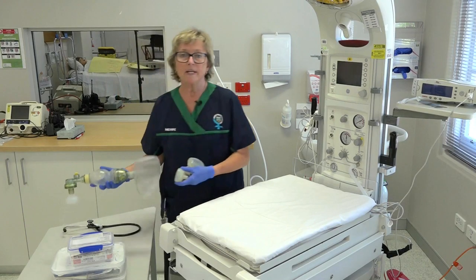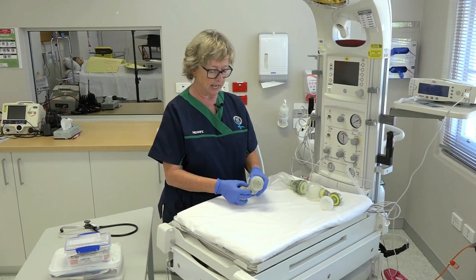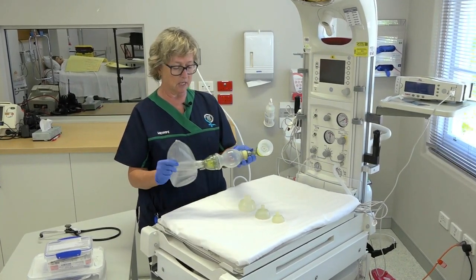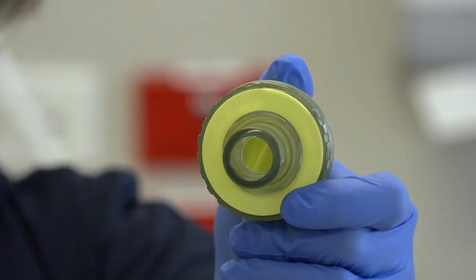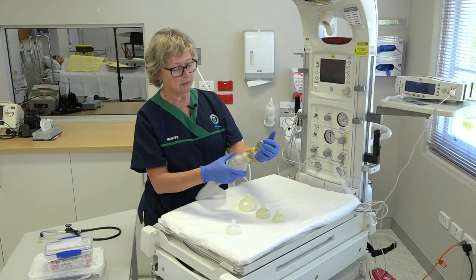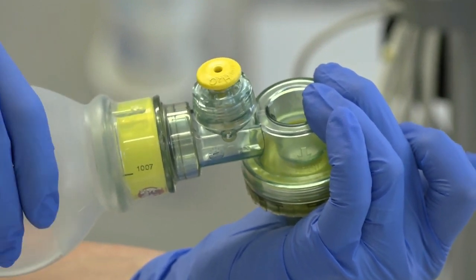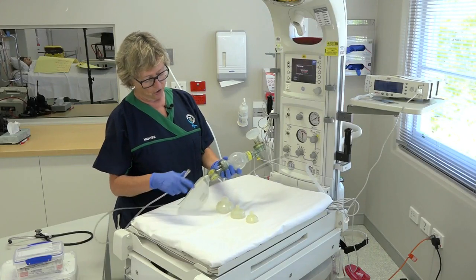We need to have a backup for our T-piece ventilator in case of a systems failure. Our backup would be our bag and mask. We need to make sure there's a duckbill valve inside and that it opens and closes properly. We also need to check that our blow-off valve works — this one states it blows off at 35 centimeters of water — and we need to see movement and hear a noise as we compress.